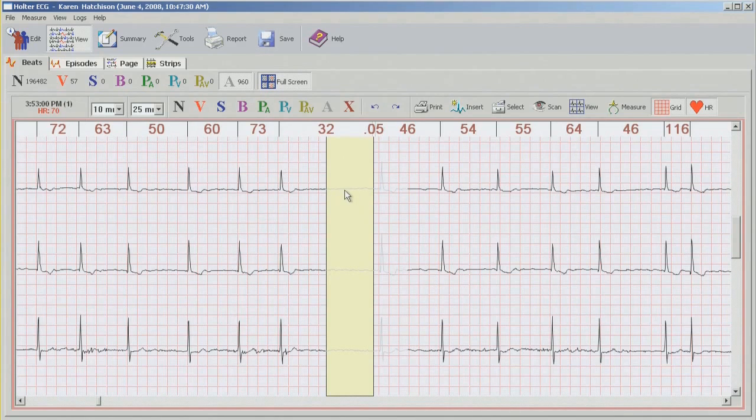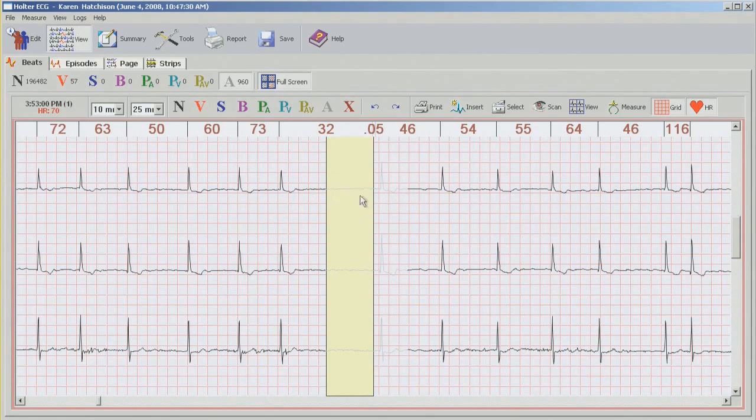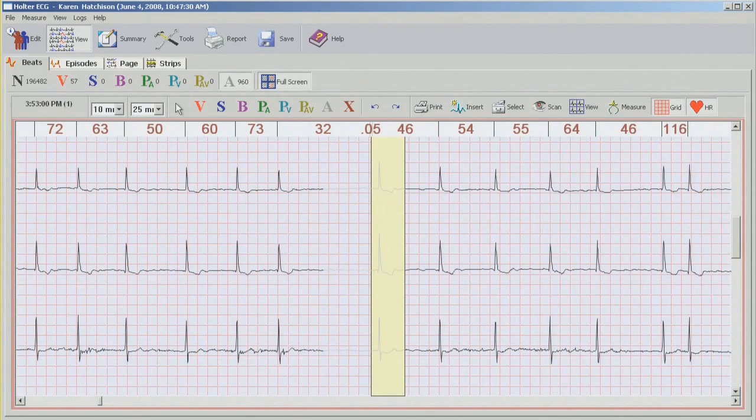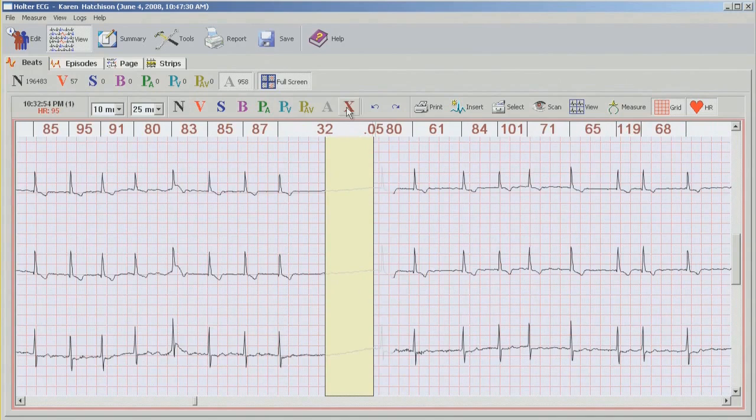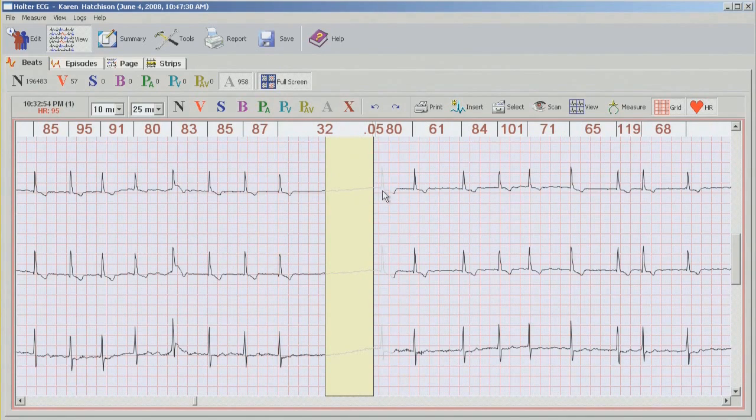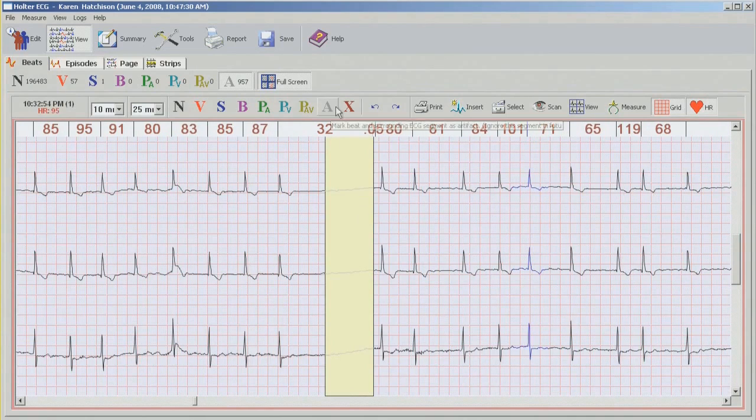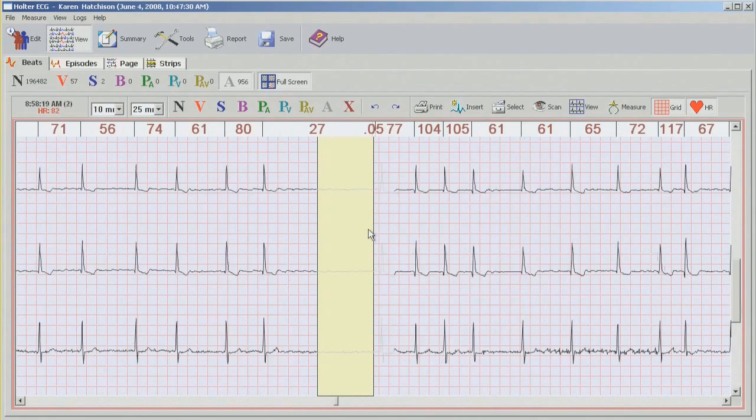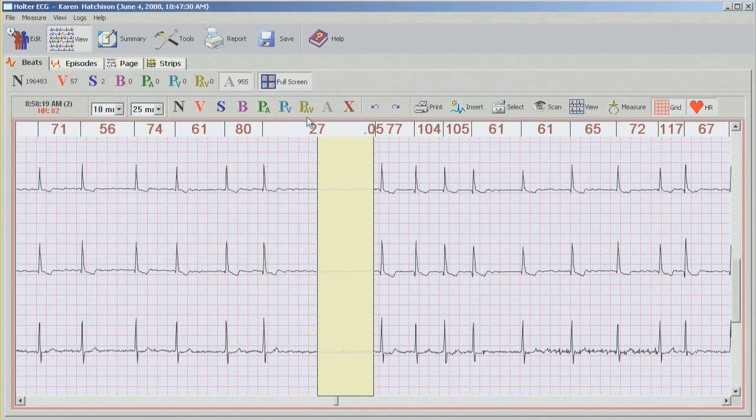And in order for this pause to be calculated into your final report, we cannot have the artifact right on the baseline. So what I'm going to do is change this beat to normal and delete this part here. If we were to leave it as artifact, the pause will not be calculated. So now what it does though, it just creates some SVPBs because of the rate change. So we're going to have to go in and change those later to normal.